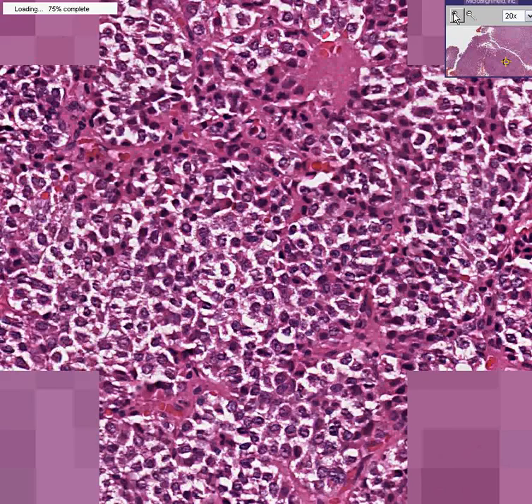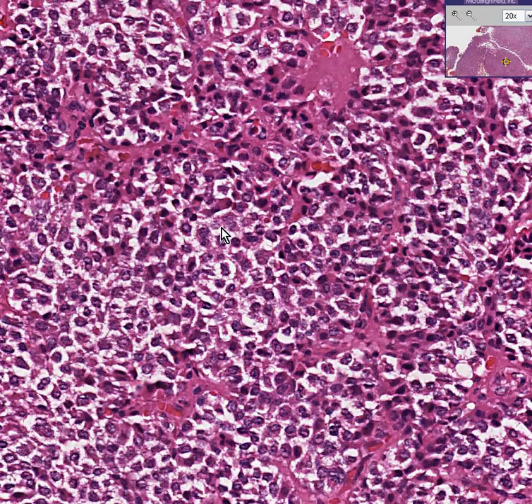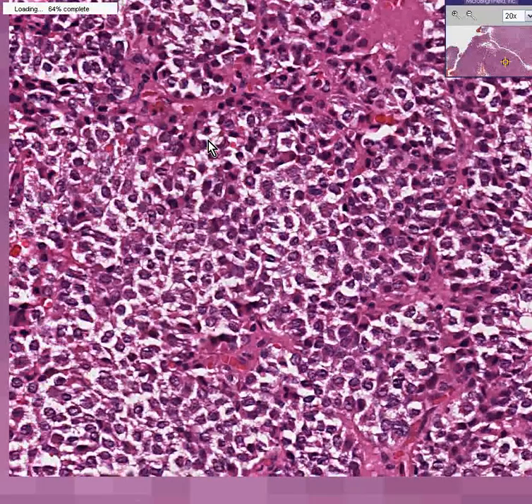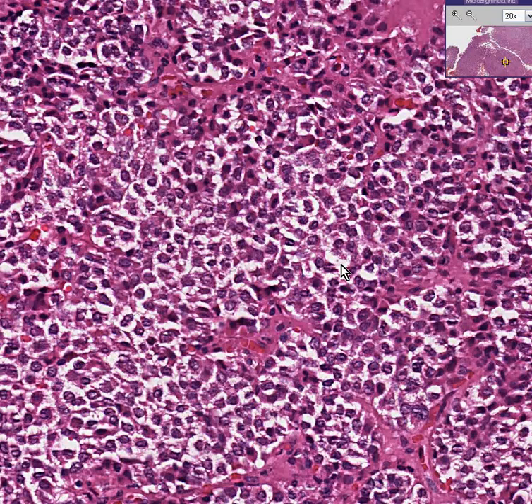If you go back to your histology and compare pictures of this to pictures of either acidophils, basophils, or chromophobes, you would probably agree that most of the cytoplasm in here looks a little bit redder than the basophils. And of course, the chromophobes don't really take up much of a stain at all. So this is an acidophilic adenoma. These cells look like acidophils, except the pattern is uniform throughout the whole tumor. So it's an acidophilic adenoma.